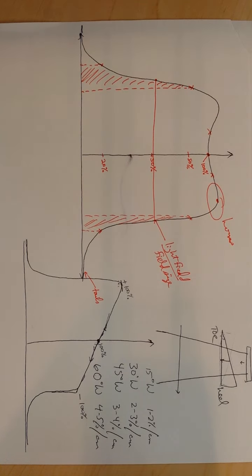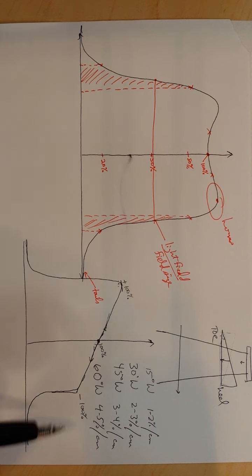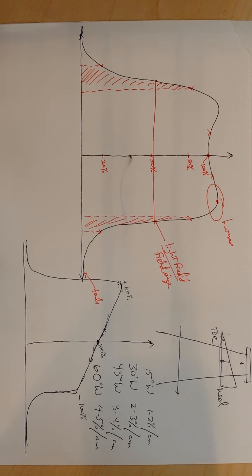In part 3 of the MU calculation, we talked about the beam profile. We described an open field profile and the wedge profile, and how the toe and heel of the wedge affects that beam profile. This ties directly into the off-axis ratio part of the monitor unit calculation equation. So if the physician or you happen to want to calculate the dose to a point that's not on the central axis, we need to apply an off-axis factor, or called an off-axis ratio.